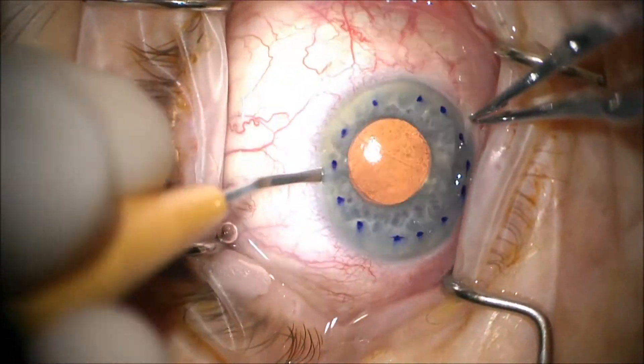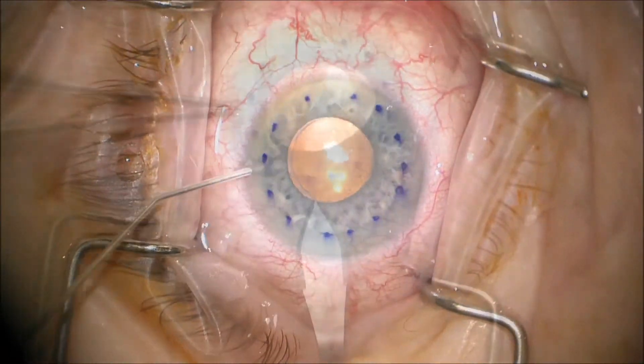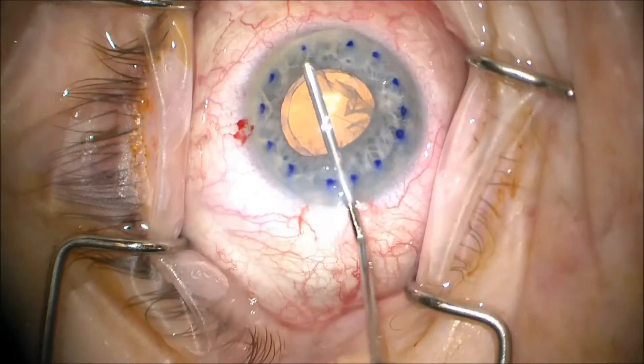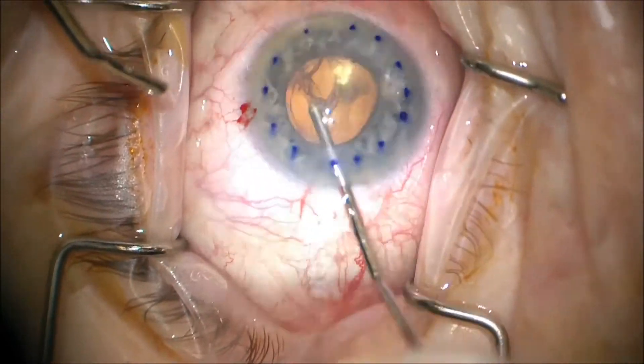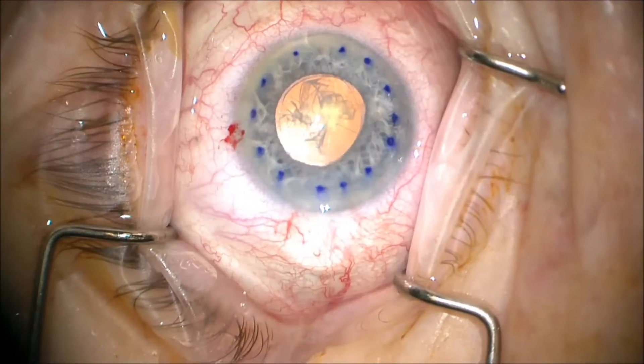We perform the surgery by doing two paracenteses, one main wound temporally. Strip the Descemet's membrane and endothelium, and remove it from the eye.